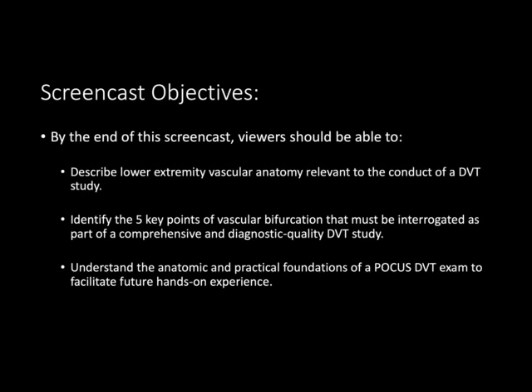We're then going to break this down into the five key points of vascular bifurcation that absolutely need to be examined and interrogated in order to conduct a complete and diagnostic quality DVT study.